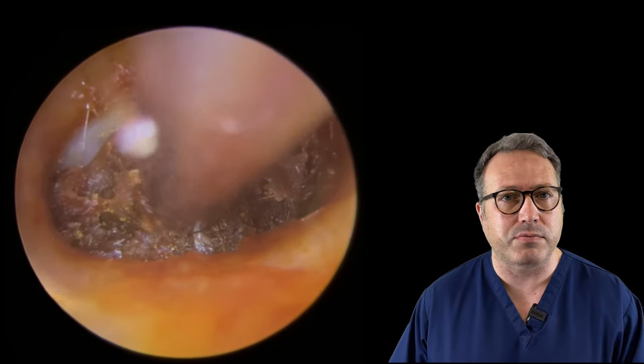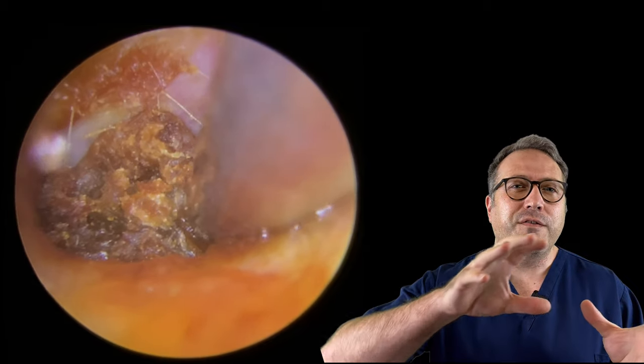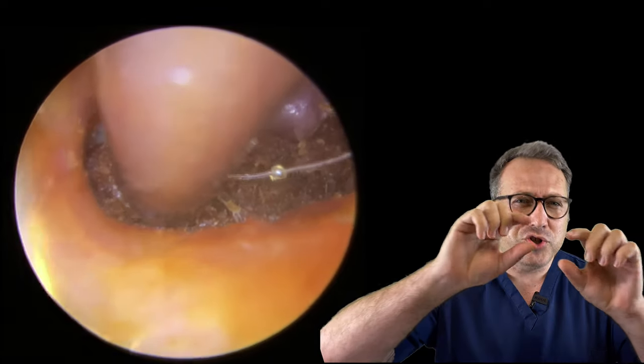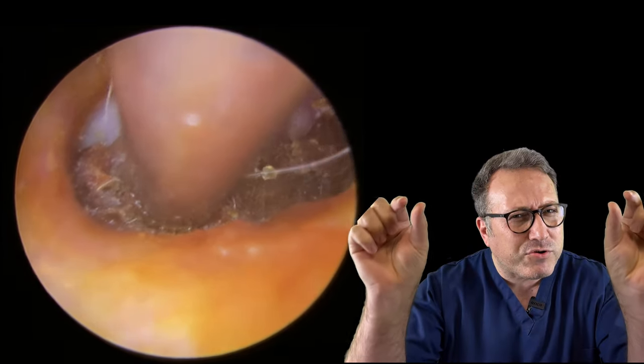As you can see now, we've managed to clear some of the top portion of the eardrum - you can just see that thin layer of eardrum at the top there.